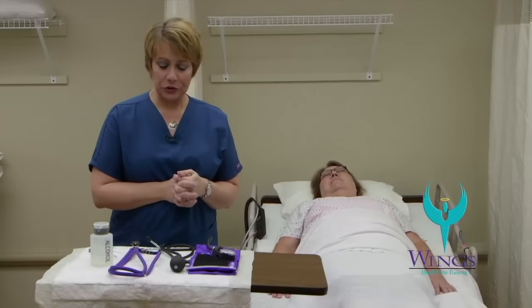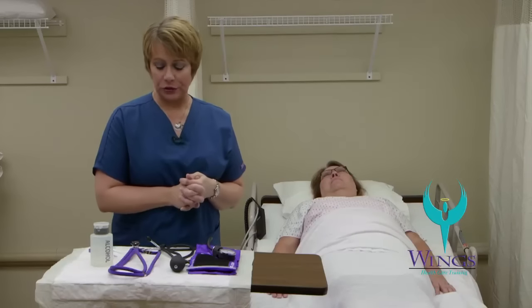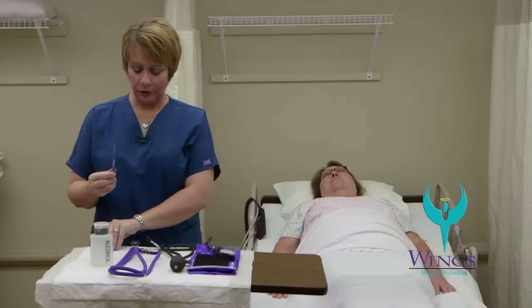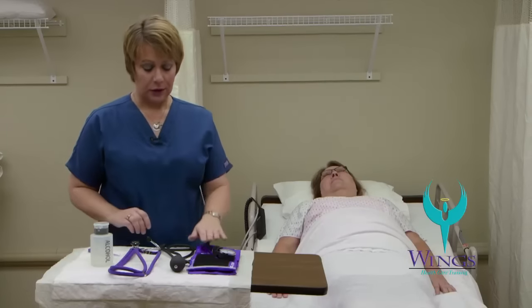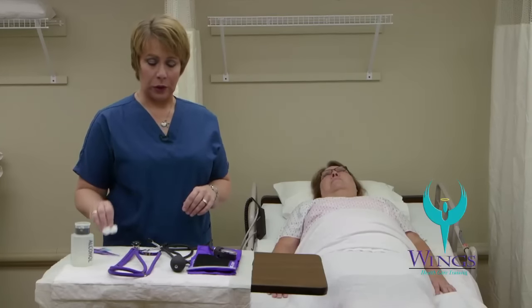The next set of skills is temperature, pulse, and respirations, and taking a blood pressure. The supplies that you'll need are an electronic thermometer, a temperature sheath, a manual blood pressure cuff, stethoscope, alcohol, and cotton balls.